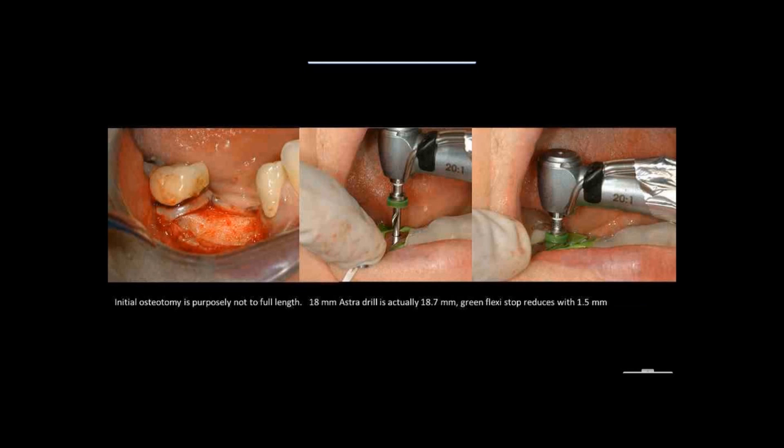Guided surgery does not at all mean flapless surgery — it just means guided surgery. In this case, I know that I want to add some connective tissue towards the buccal of this site.